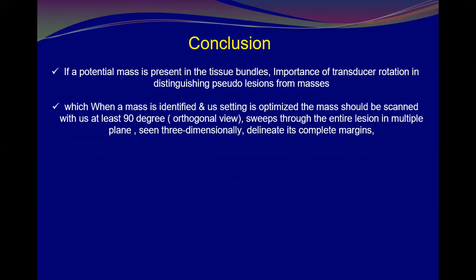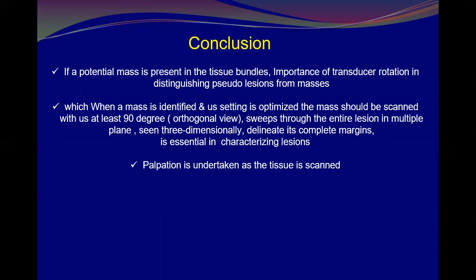When a mass is identified and the ultrasound settings are optimized, we have to scan in a perpendicular or orthogonal view at 90 degrees, and we have to sweep throughout to evaluate the margins. Visualizing the lesion in a 3-dimensional pattern is essential to evaluate and characterize the lesions.